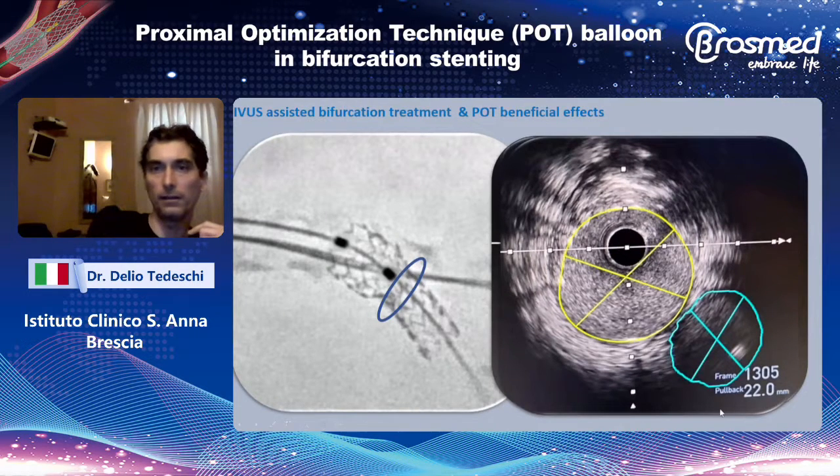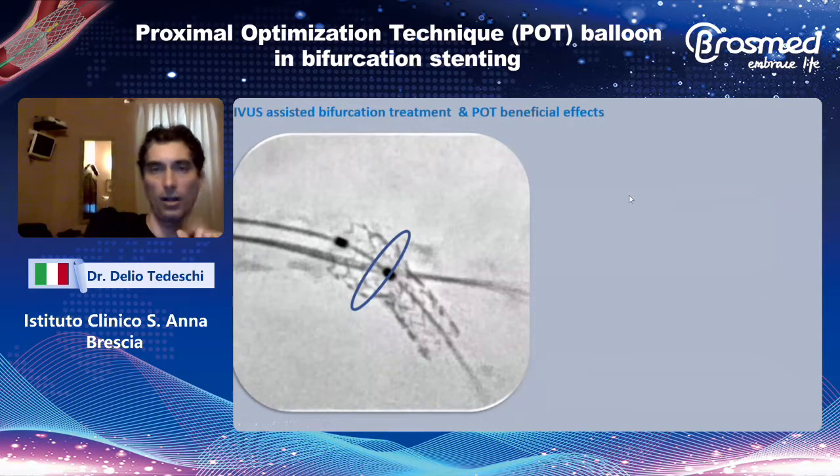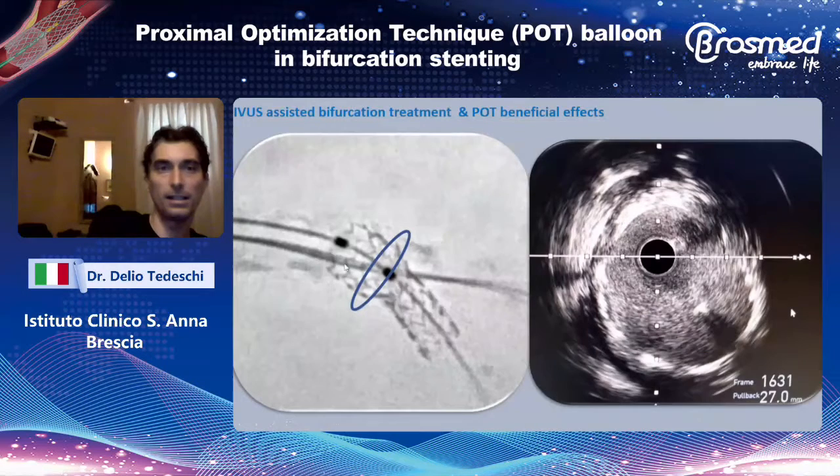We can see here the diagonal and the LAD. And this imaging shows an eccentric calcification of the plaque, very eccentric at the level of the bifurcation. Above all, the analysis at the level of the ectasic portion was very, very good.